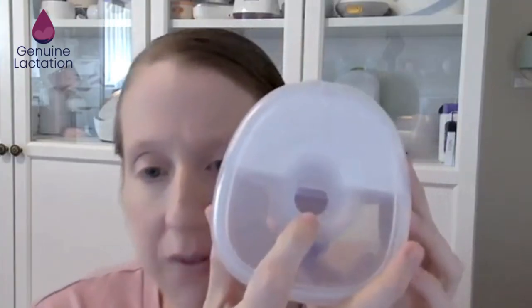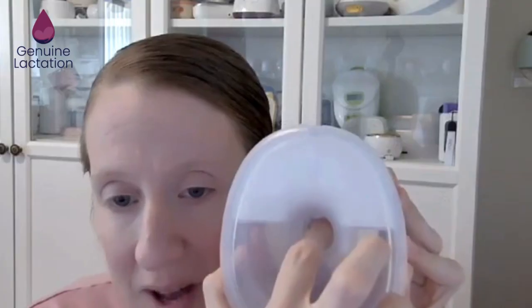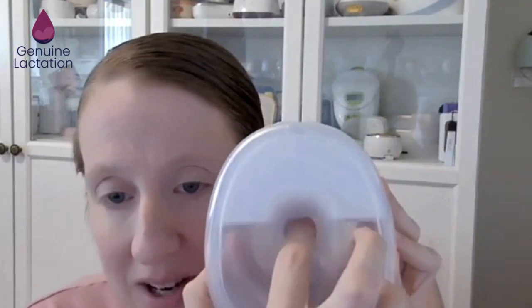All in all, the texture — unless you have elastic nipples — they're probably going to be okay. I do like the texture, but they missed the length. The reason for the length is that if you look in the back, you can actually see this white wall where that comes down into the tunnel. Your nipple could actually make direct contact with that. I pulled a Tommy Tippee insert because Baby Buddha is owned by Mayborn, and Mayborn owns Tommy Tippee.